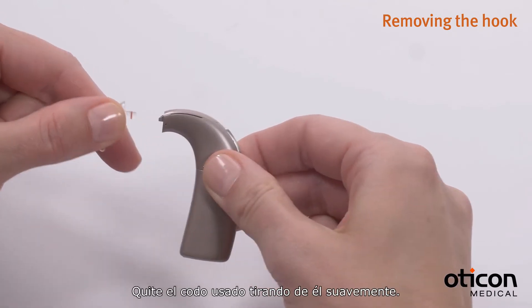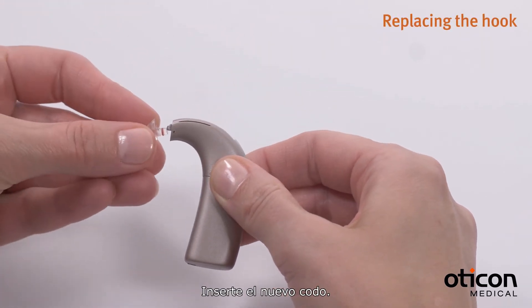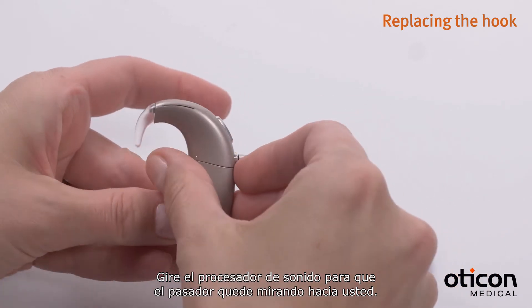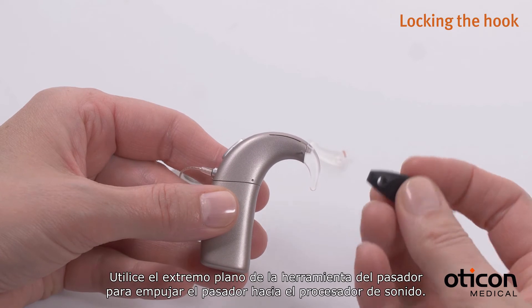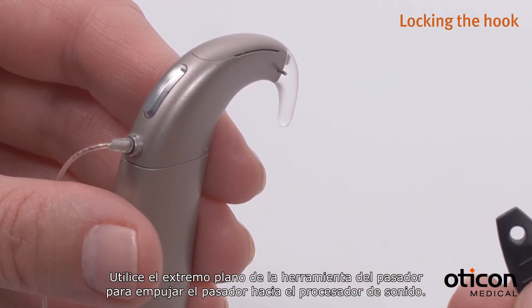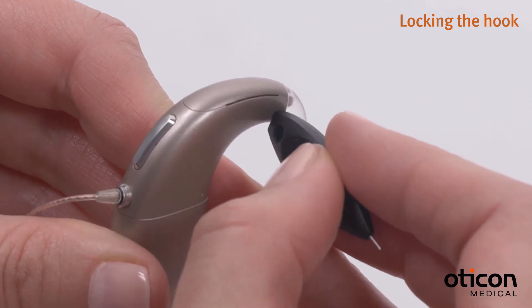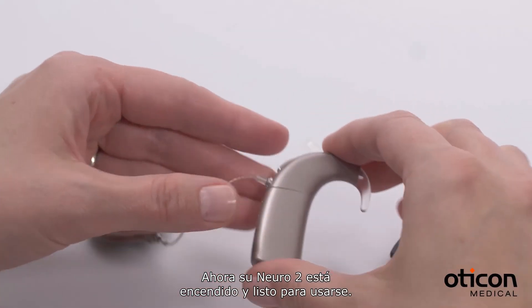Remove the used hook by pulling it gently. Insert the new hook. Turn the sound processor so the pin is facing you, then use the flat end of the pin tool to push the pin back into the sound processor. Your Neuro 2 is now ready for use.